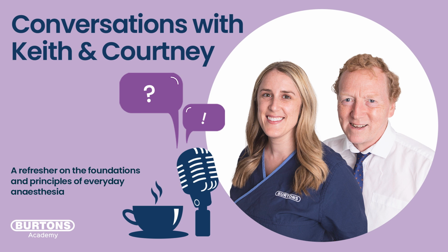But you're right. If you see that 87%, I start to think, okay, is my patient okay? Why would they spontaneously go from saturating really well to suddenly not saturating in those healthy patients? And I think, there's got to be something wrong with delivery here. That's when I turn my attention straight to the flow meter, straight to the gases that have been delivered, and just want to make sure that what I had set the flow meter to hasn't been knocked by somebody, that there is still gas in the cylinder or the oxygen concentrator is still doing its thing.